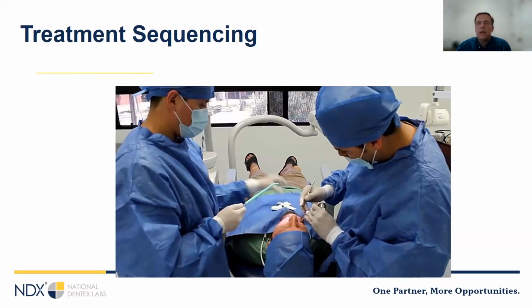Bite changes, we want to get into those early as well, because it's really nice to have a stable bite before you go to the final restoration. One of the things we want to work with these cases is to, by the time we get to the final, we already know where the teeth need to be, the patient's seen it, we know where the bite is. It makes our final much easier.